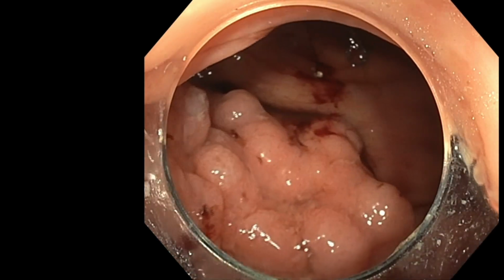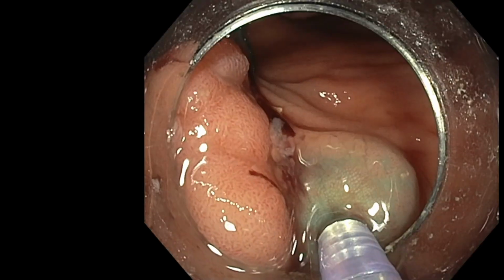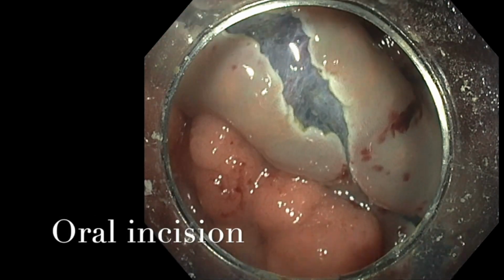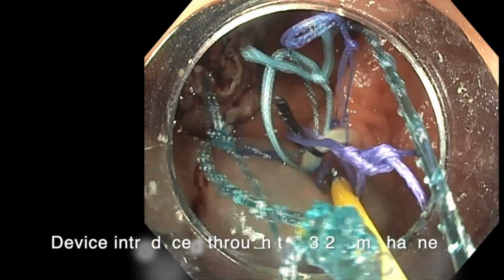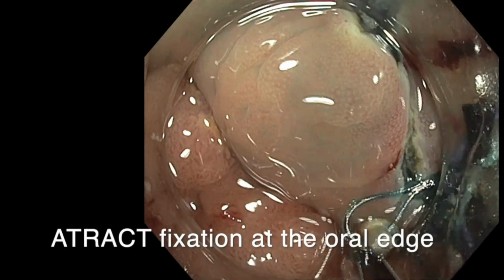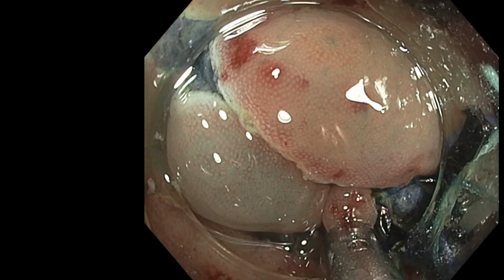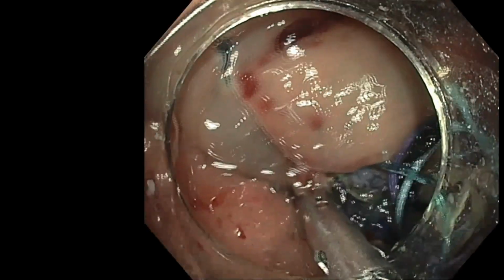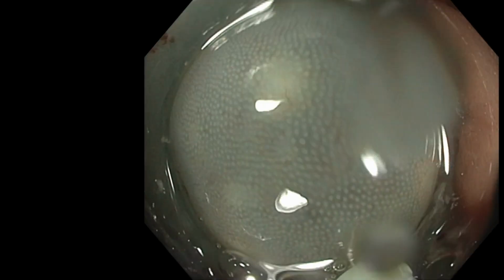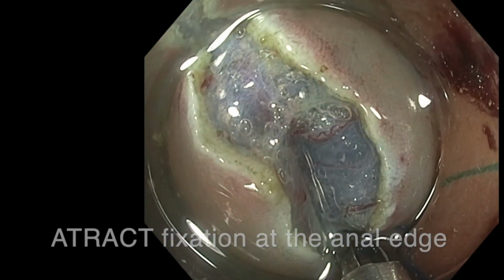And finally, you will have this result. It's not the same lesion, but it was a similar lesion with an area of pattern which was quite difficult. I did first the oral incision, introduced the device of traction, and fixed the first point on the oral edge where the incision was completely done with trimming.